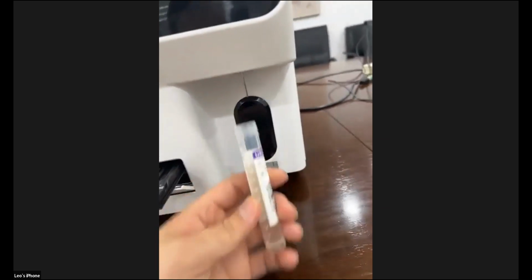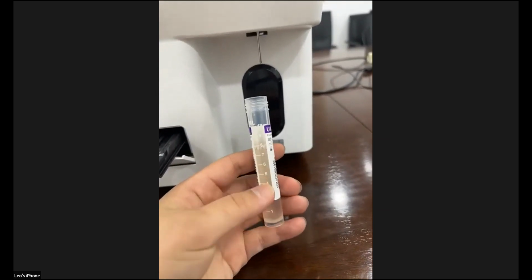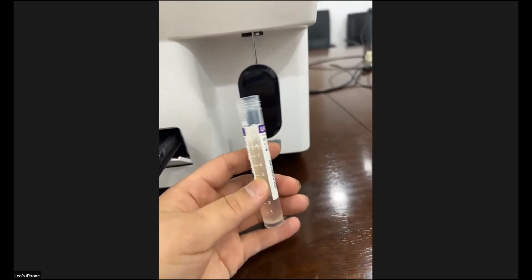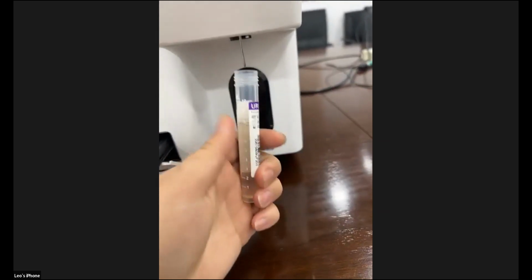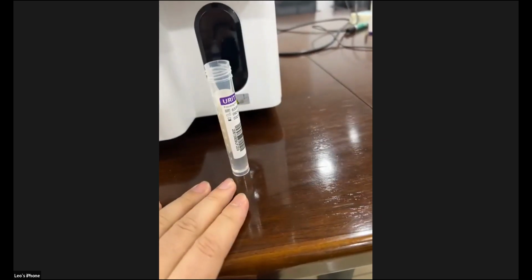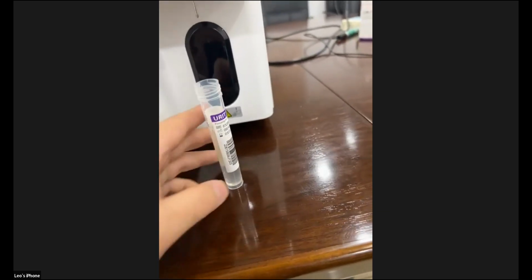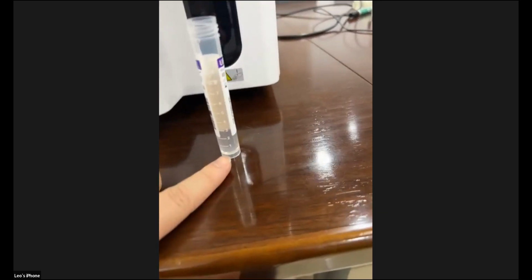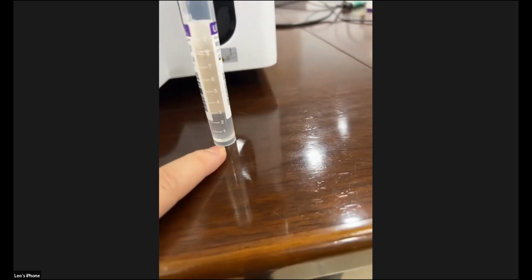You need to make sure that the material or cells in the tube exist everywhere in the sample. If the urine is left for more than two hours, most of the cells or material will go to the bottom of the tube.